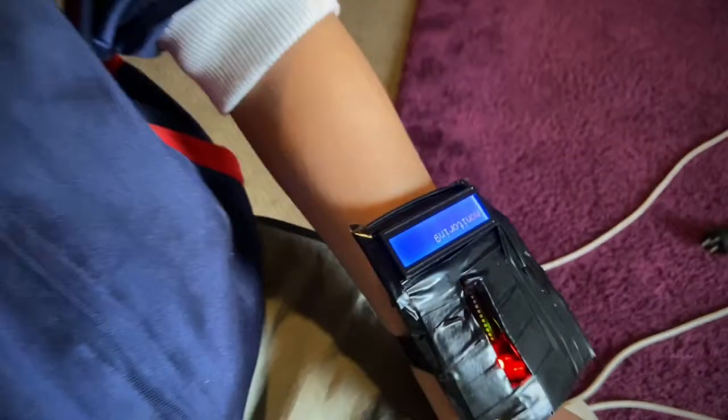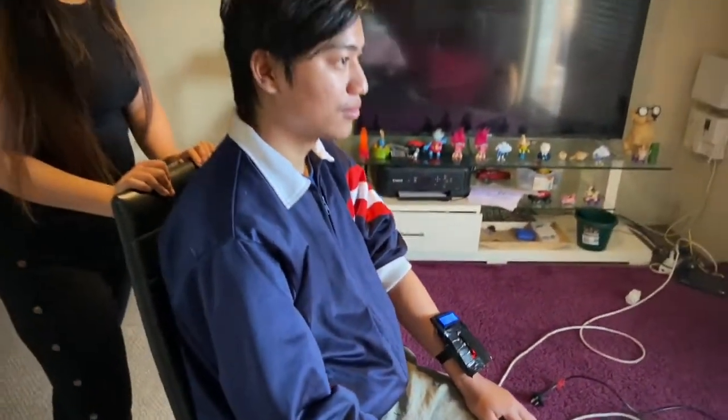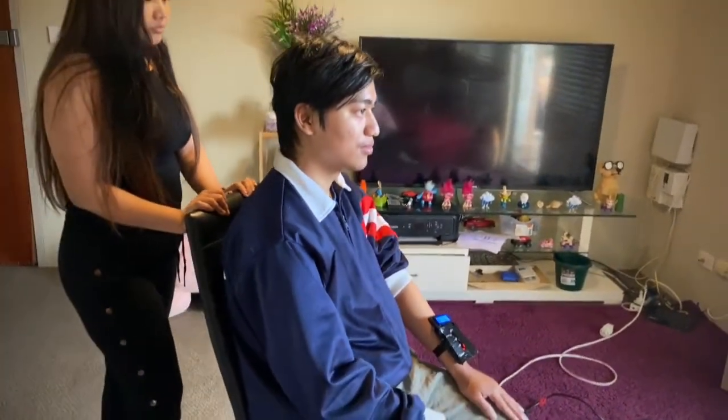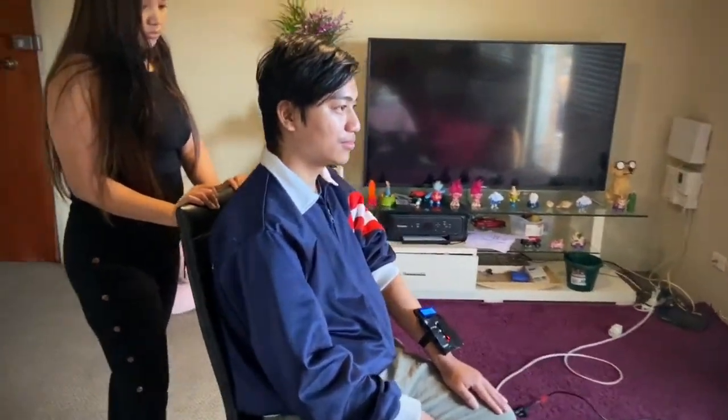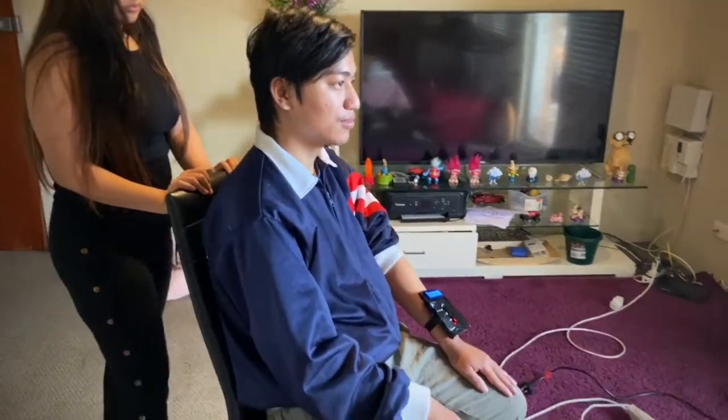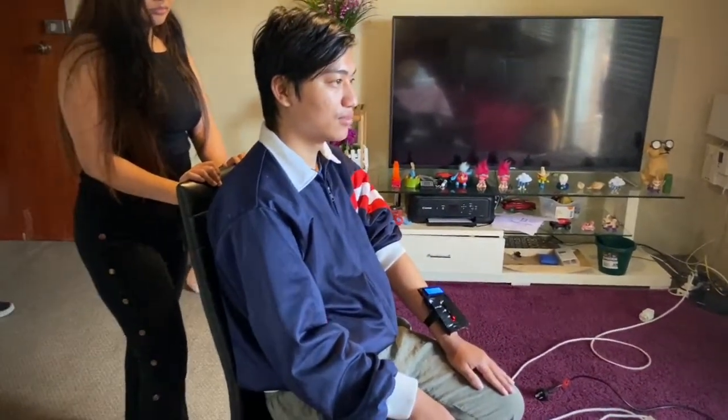So now I'm going to show how it works. I'm using my friend and he's wearing my device.